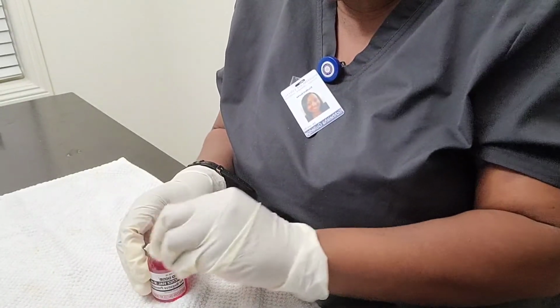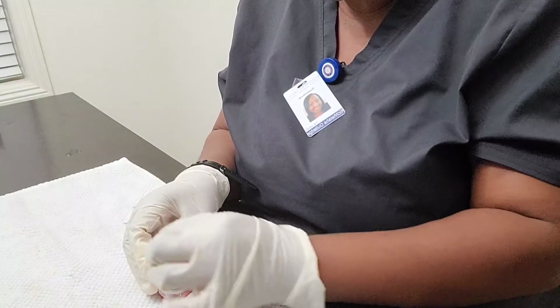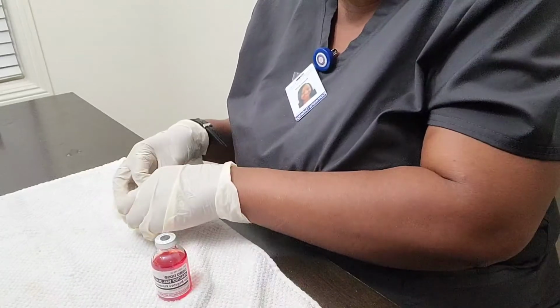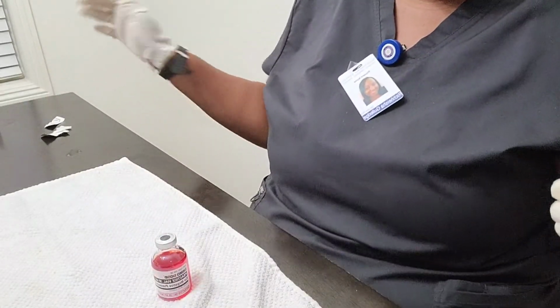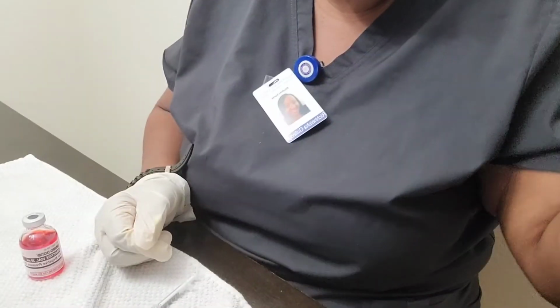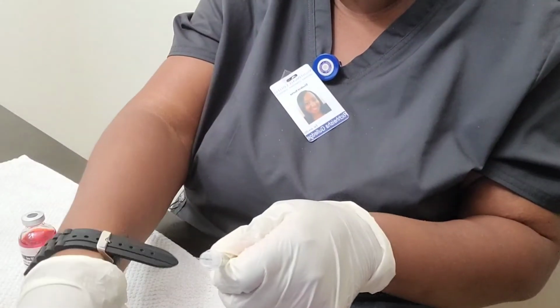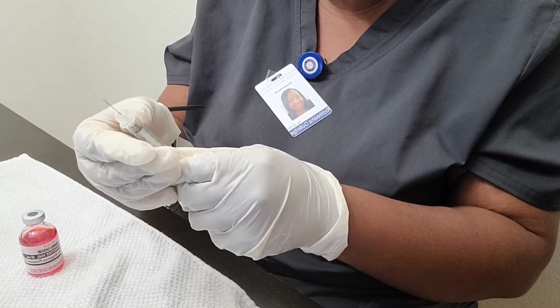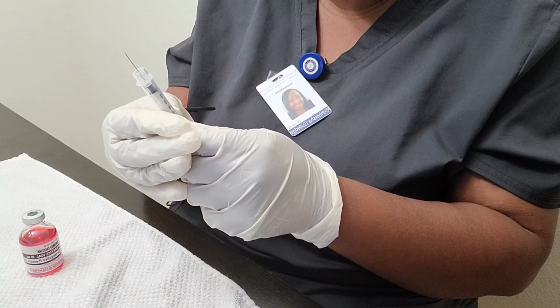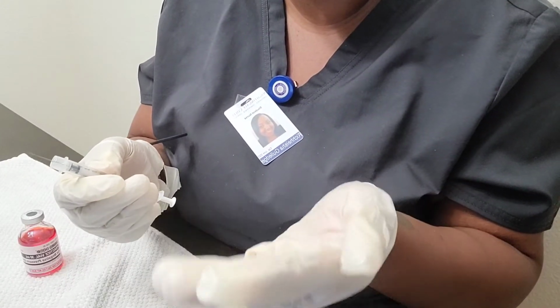Okay, and so I will go ahead and clean the top of the lid. Okay, discard this. Then I will go ahead and take my syringe and remove the cap, and then I will fill the syringe with the same amount of the medication, which is 0.1.